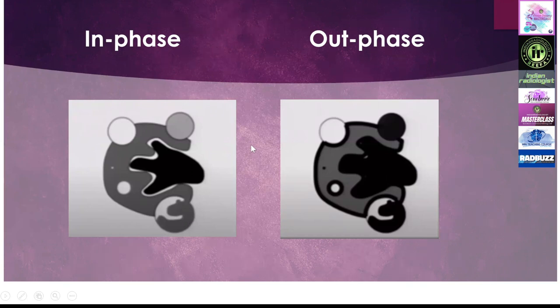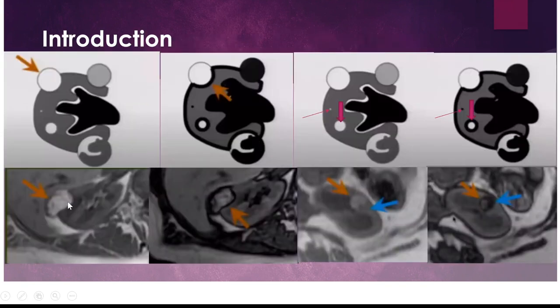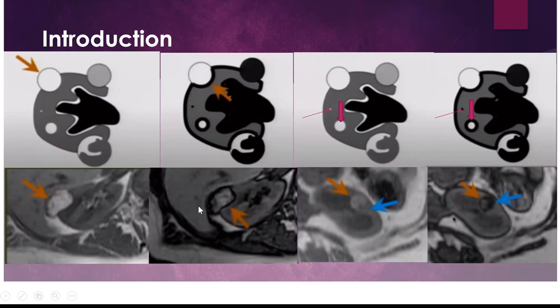In and out of phase imaging is especially diagnostic for angiomyolipomas and some clear cell renal cell carcinomas. Angiomyolipomas come in different flavors — they can be very fatty, showing the India ink artifact at the fat-water interface, which is diagnostic of angiomyolipoma. Fat will suppress on fat sat images. Intraparenchymal angiomyolipoma shows the India ink artifact all around it as well as chemical shift artifact. Some tiny lesions completely drop out on out-of-phase imaging. Lesions with less fat will show a drop in that portion on out-of-phase imaging.